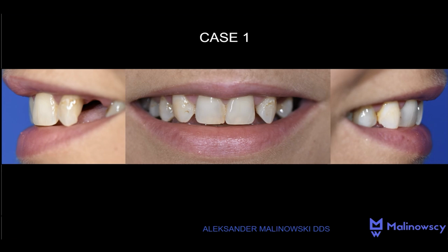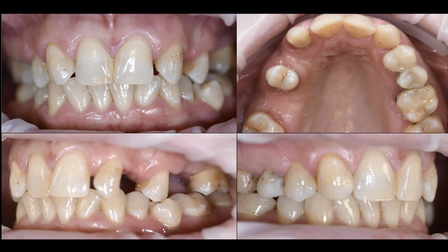In the first case, you can see a woman with missing teeth, canines in the place of lateral incisors, a crossbite, and a general lack of harmony and aesthetics. Presenting this case will illustrate how the facial scanner can be utilized for treatment planning that addresses these complex challenges.